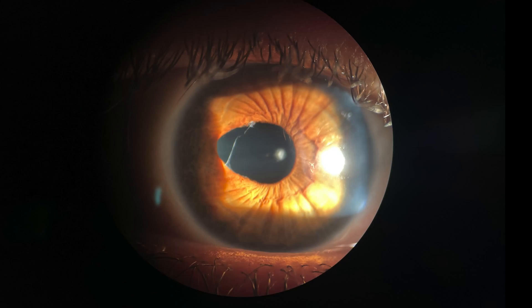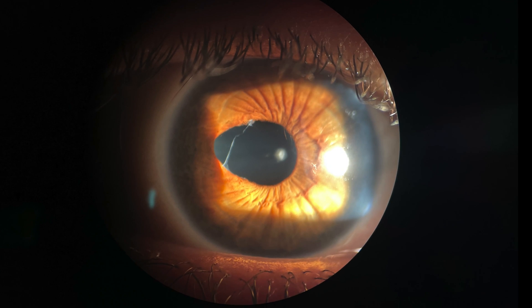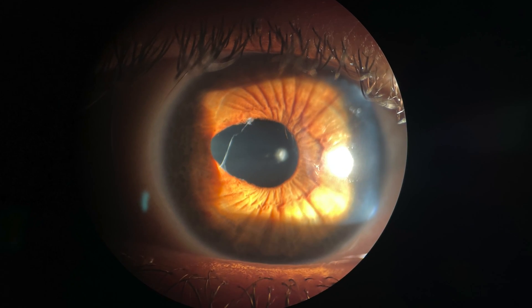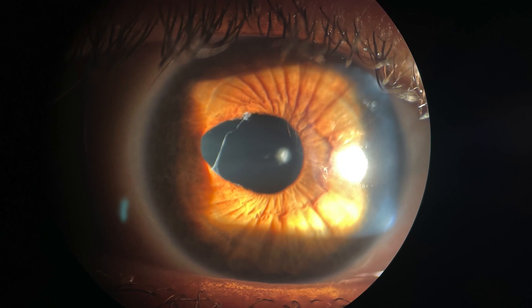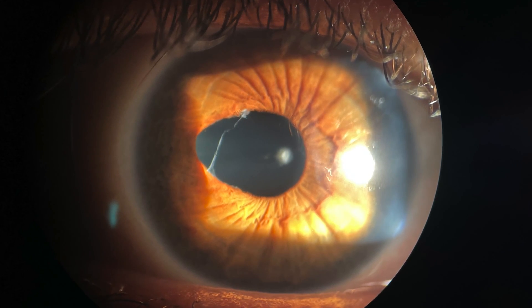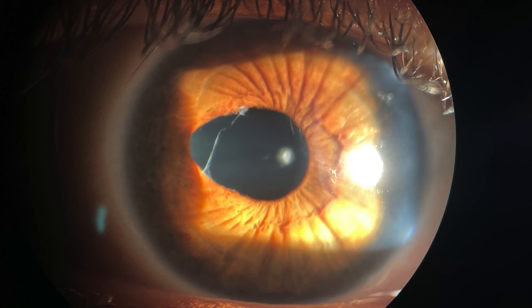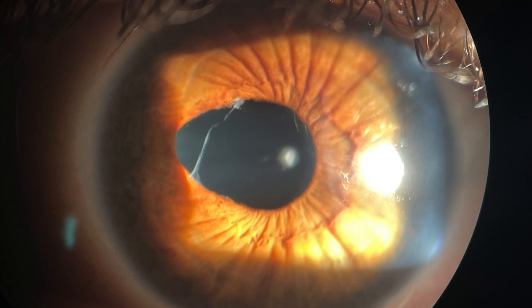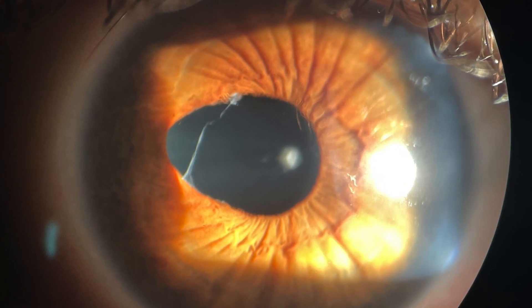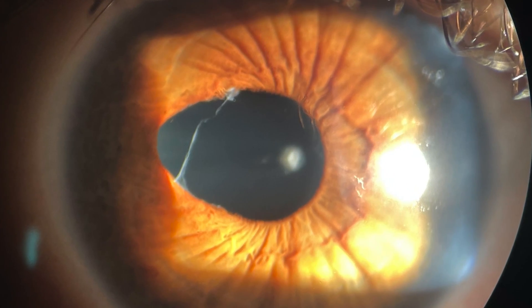This 28-year-old woman sustained an injury to her right eye at the age of 6 that damaged the lens, the iris, and the pupil inside of her eye. The iris is the brown colored structure inside the eye. The pupil is the central opening through which we see, and it expands and constricts to control the amount of light that enters the eye.